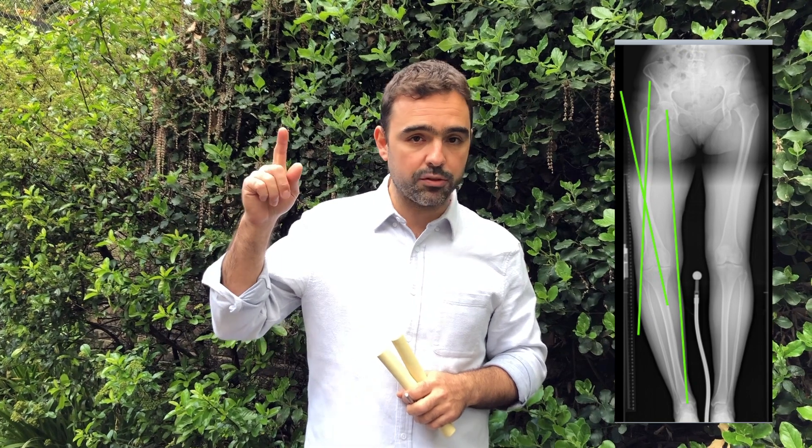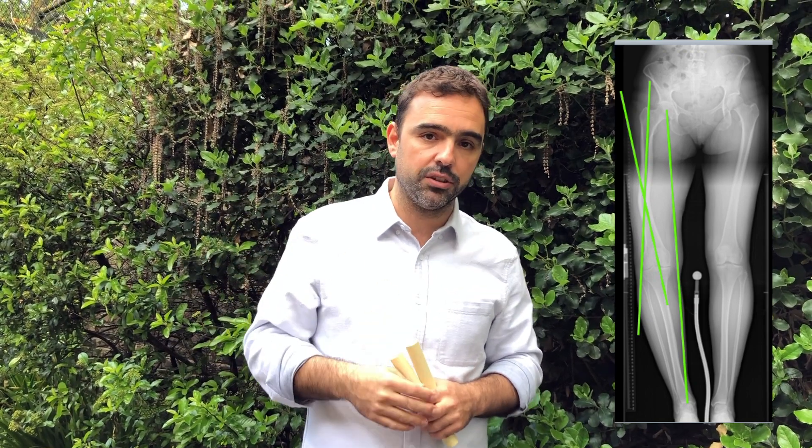This patient is a 30-year-old woman who had a fracture when she was younger in the right femur. It was treated non-operatively and she comes to us with medial side knee joint pain for the last couple of years. When we analyze the deformity, we can see that the mechanical axis does not pass through the middle of the knee but medial to it, which justifies her symptoms.